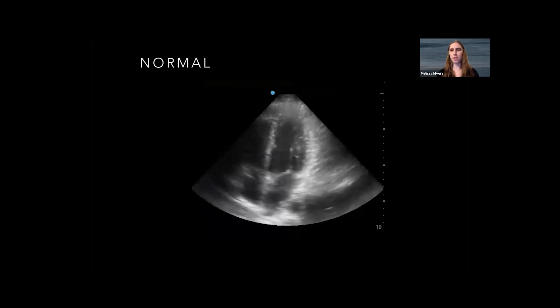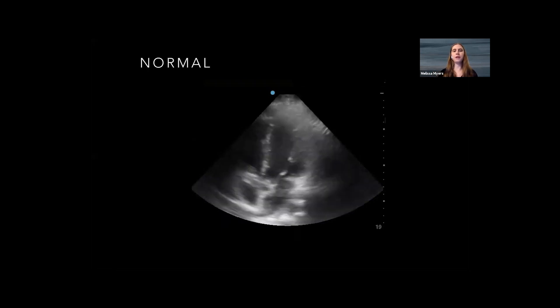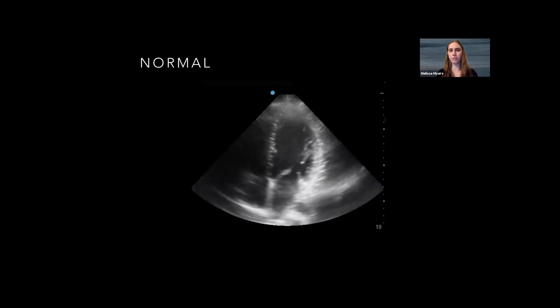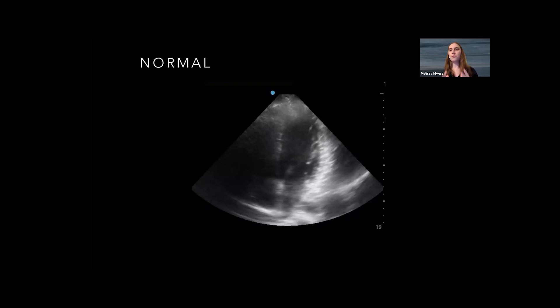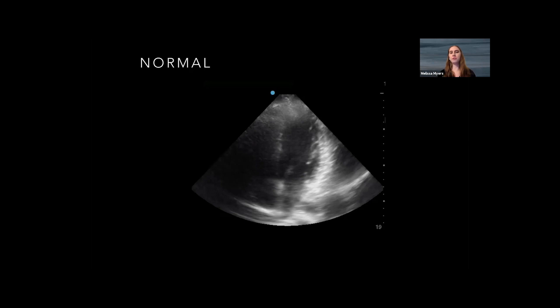The apical four chamber is really the heart of any exam focused on the right ventricle, because this is the view that allows us to fully visualize that ventricle for the first time. In an apical four chamber, we want the interventricular septum to be as vertical as possible — if it's tilted to one side or the other, it's hard to know exactly what cut through the heart you're making, and you may falsely overestimate the size of the right ventricle. Here we see all four chambers: the chamber closest to the blue dot is the right ventricle, then the left, and the two atria at the bottom.